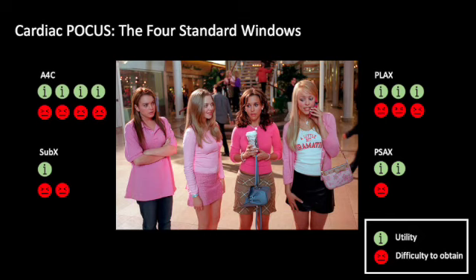If you've ever seen the cinematic masterpiece known as Mean Girls, you probably recognize these 4 icons. While each of these characters has their own strengths and own challenges, their own contribution to the "on Wednesdays we wear pink" dynamic, the movie wouldn't be the same without any one of them. Similarly, the views I'm going to introduce to you here have differing clinical utility. And while I won't dwell here on this poor analogy, feel free to come back to this slide after you've learned more and drop a comment if you agree or disagree with my assignments, or see if you can figure out which one applies to which.